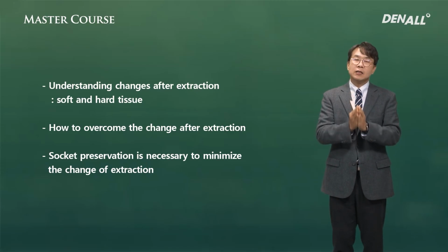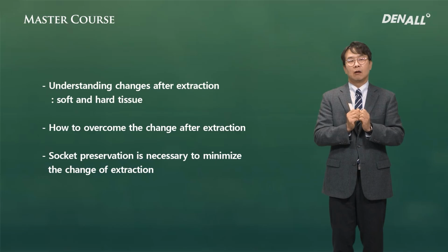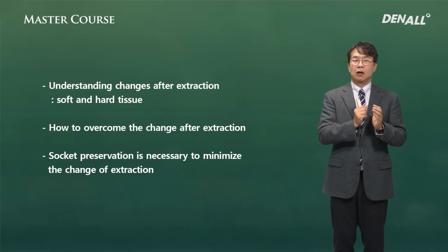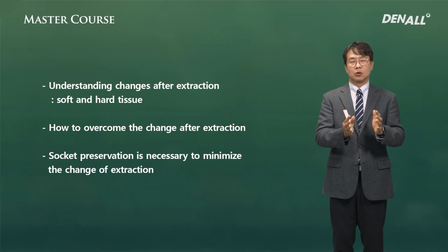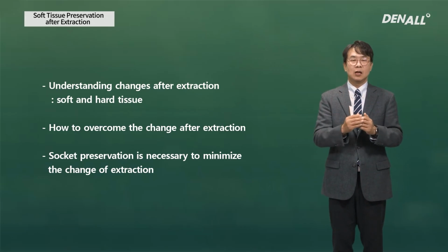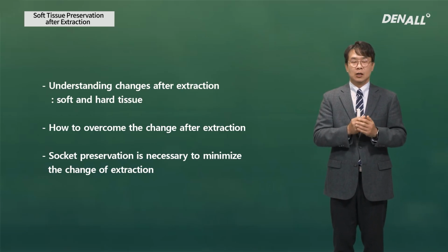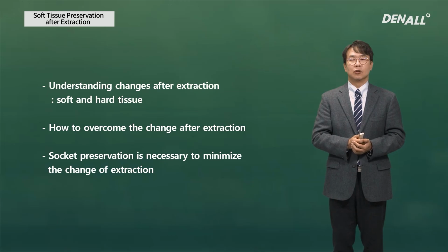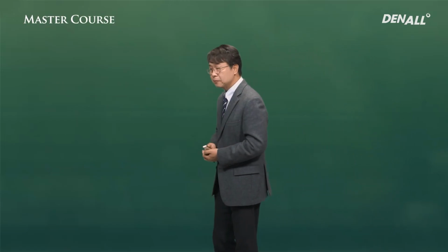From an implant perspective, socket preservation is a favorable procedure to maintain soft tissue and hard tissue. So it is far better to use socket preservation compared to not using socket preservation, to maintain hard and soft tissues.